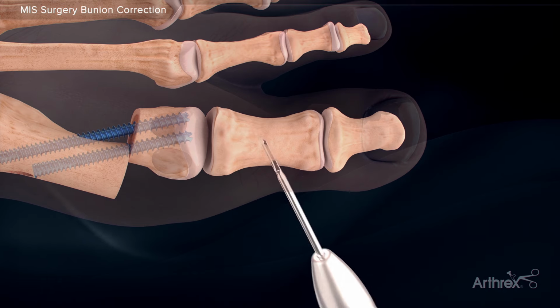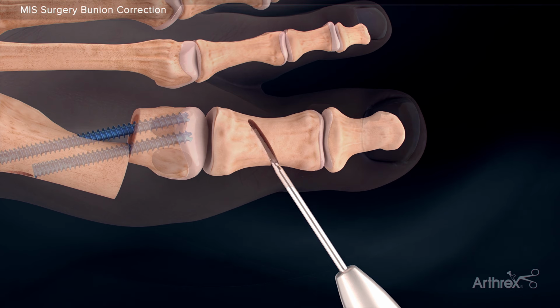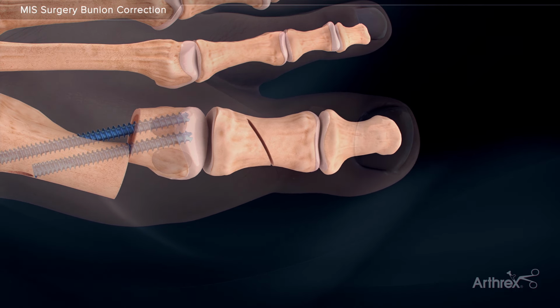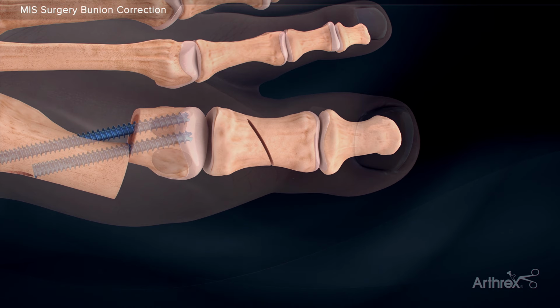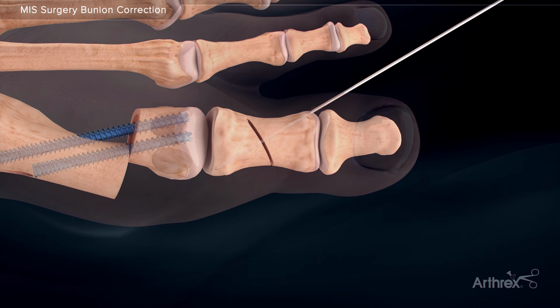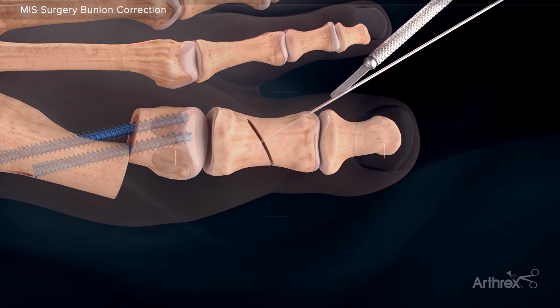Rotate the burr handle plantar and then dorsal to create a transverse cut in the bone while maintaining the lateral cortex to act as a hinge. Gentle manipulation is applied to reduce and compress the osteotomy. Next, place a 0.86 mm guide wire across the osteotomy from distal lateral to proximal medial.